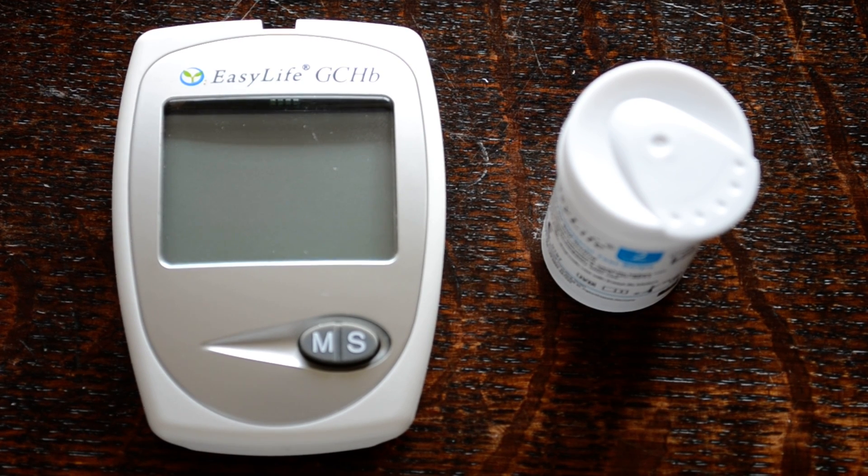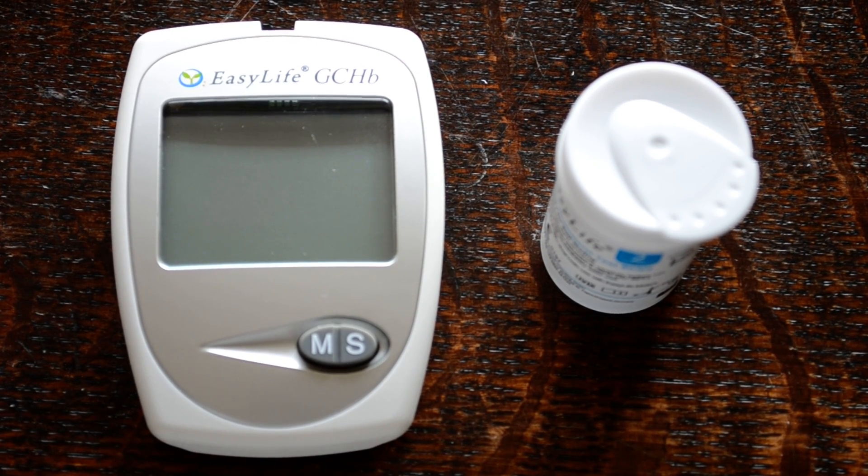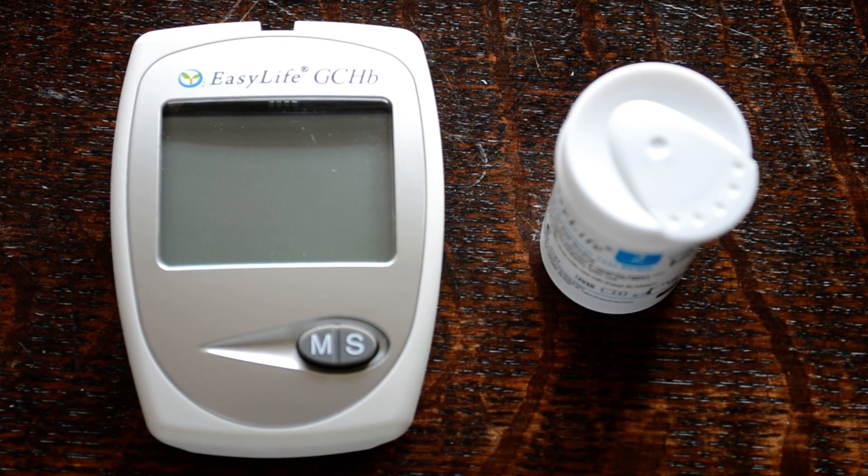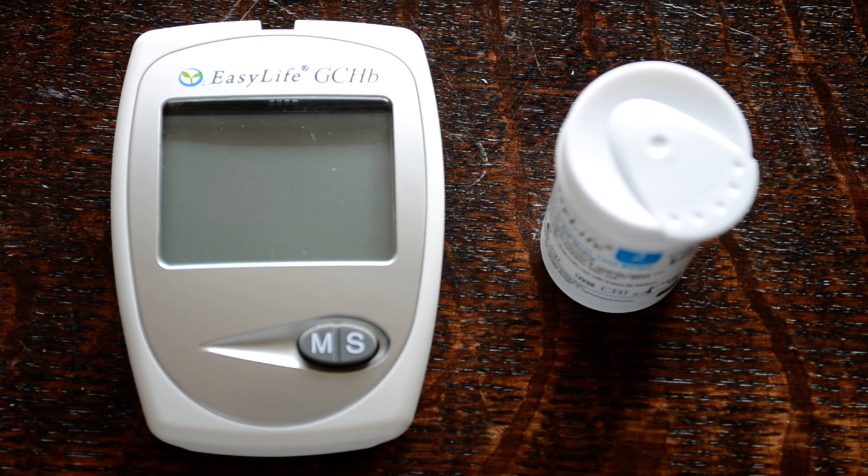Welcome to this video presentation. We're going to talk you through how easy it is to do a blood cholesterol check using the meter system demonstrated in front of us — the Easy Life. It's a triple meter system, which is great value. You're not just buying a meter that does cholesterol; it can also check your glucose levels, total cholesterol levels, and haemoglobin levels — the chemical that carries oxygen around the body.